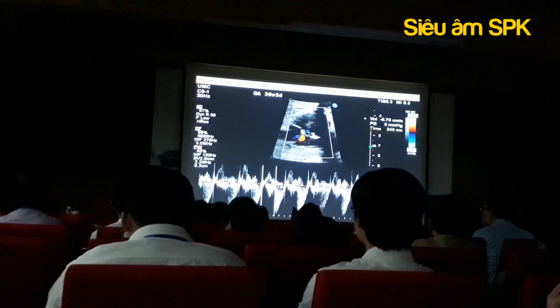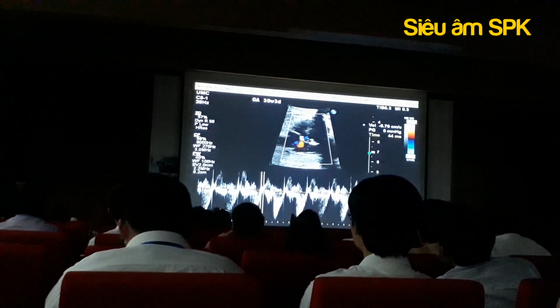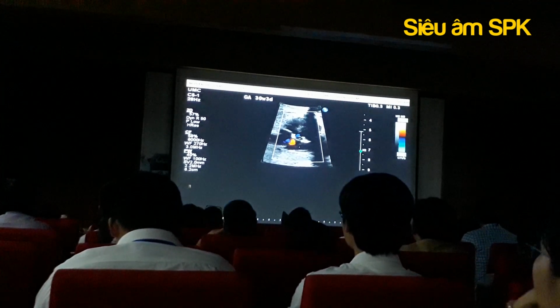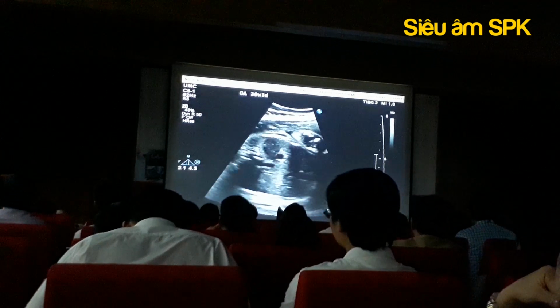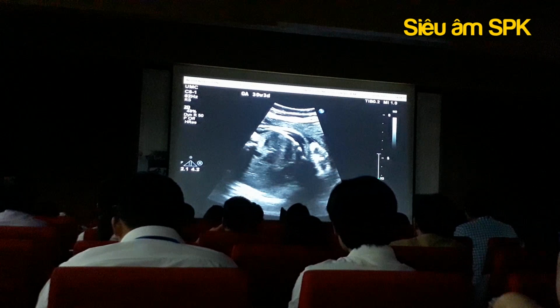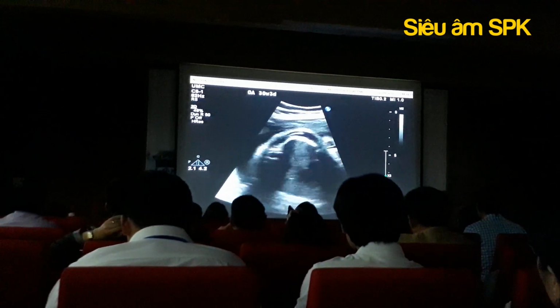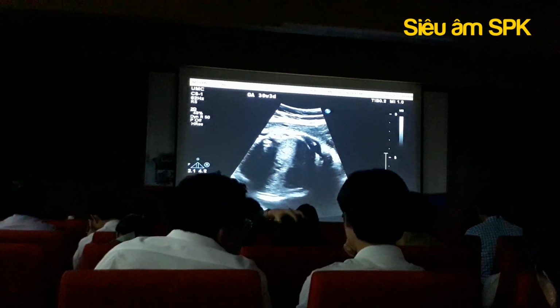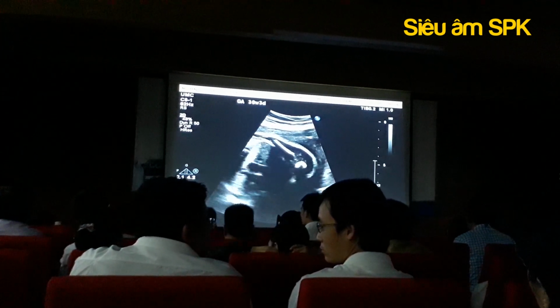So from aortic valve closure to onset of mitral inflow, 44 milliseconds here, so that's normal. So everything that we've seen tells us that the ventricular function is normal, our venous Dopplers were normal, and the heart size is normal, so this fetus is otherwise looking pretty healthy from a function standpoint, but there clearly is the structural abnormality.